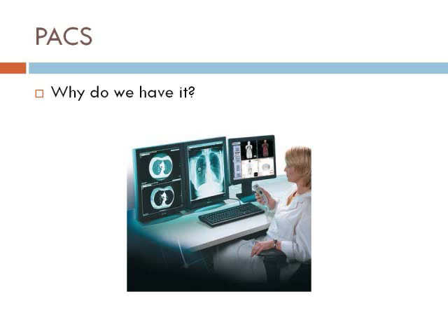The PACS system also has better capabilities in which it can allow manipulation of the images. They can zoom in and out of the images. They can also fix any contrasting issues that may occur when the film was taken.